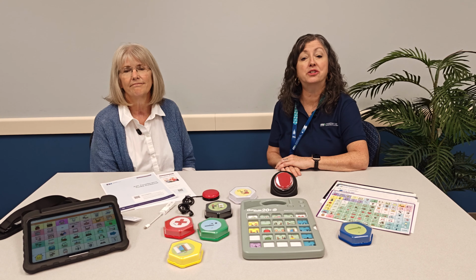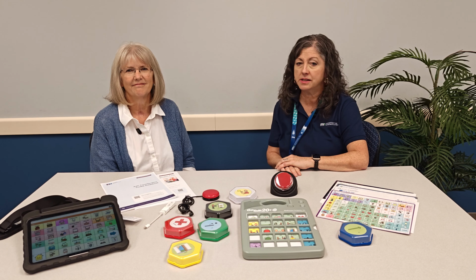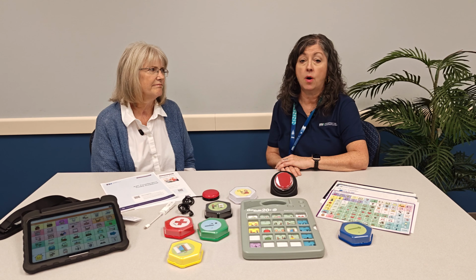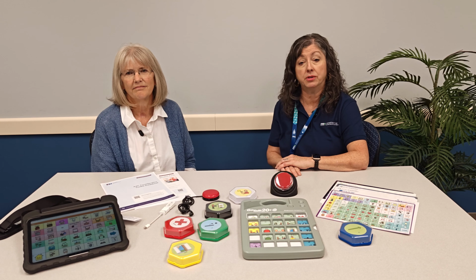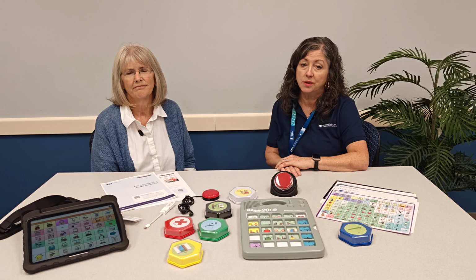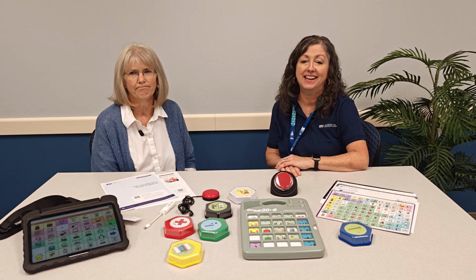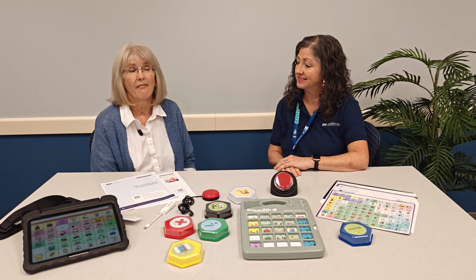Finally, this section introduces alternative access methods. If direct touch isn't possible, you'll learn about other options like switch scanning, partner-assisted scanning, or eye tracking, and how these methods can support communication success. By the end of Section 2, you'll be ready to begin trialing the devices and apps with your student, using strategies that fit their strengths, needs, environments, and tasks.